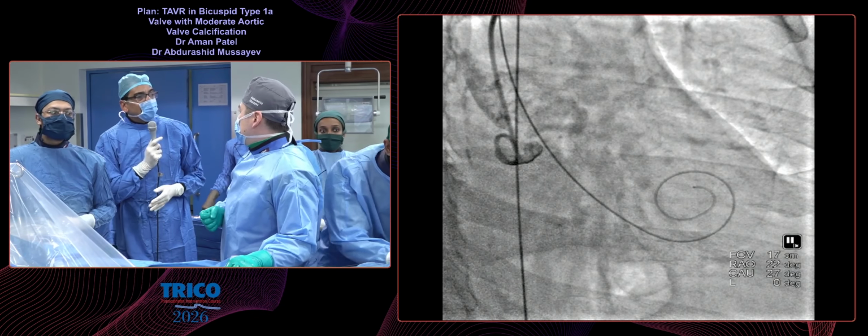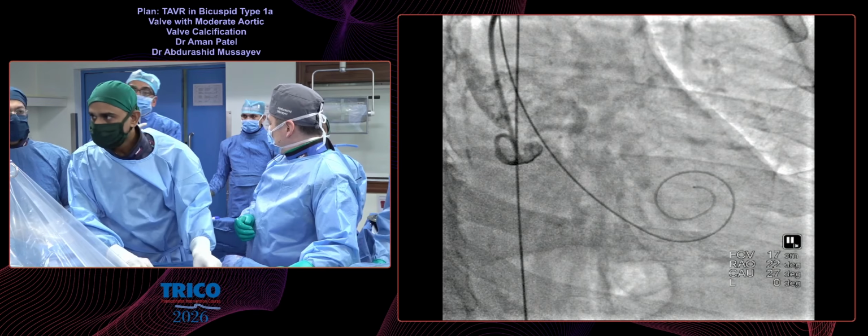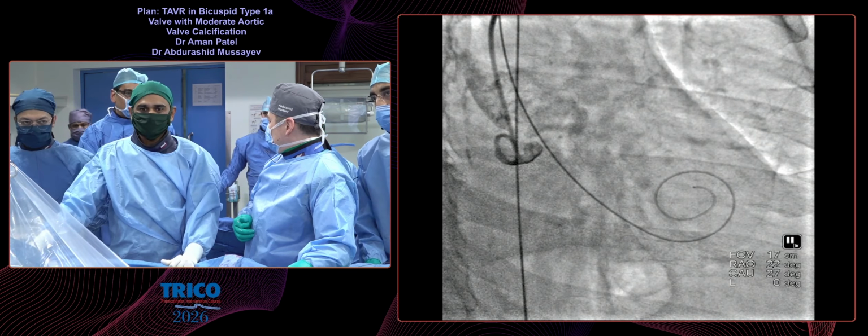What was the ICD? About 26, right? 28. Yes, so the intercommissural distance was 28. And that is why I'm a little bit concerned that if we did not predilate, then we might be chasing it afterwards with the PVL.